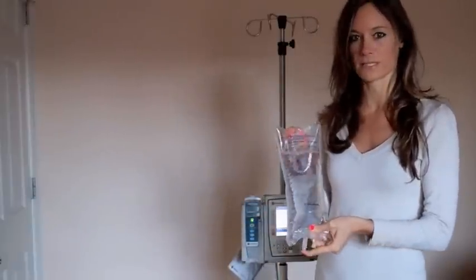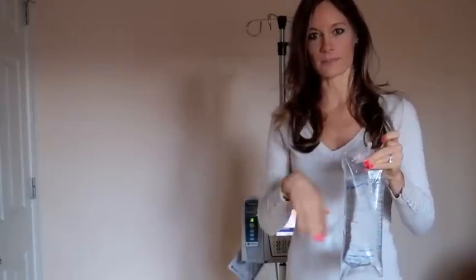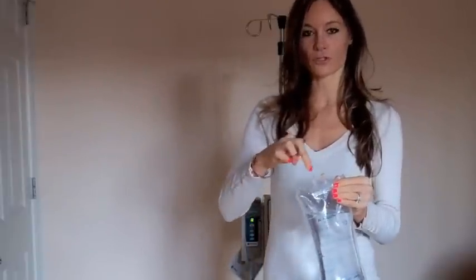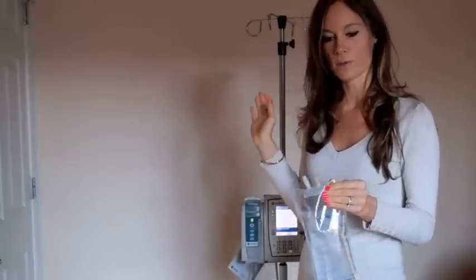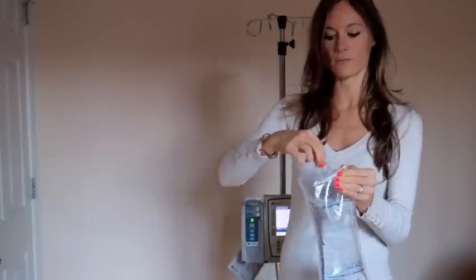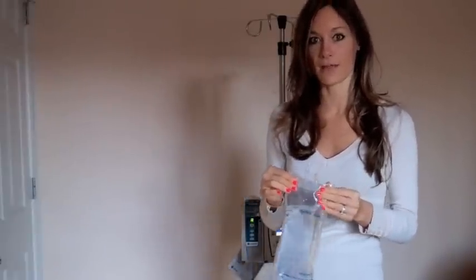So we have our bag of normal saline here. Usually it comes all wrapped up, but this one's open because it's just for demonstration purposes. It has a little closure here that we just pop off. After we wash our hands, we open the container and pull the top off. And then we get our IV tubing.